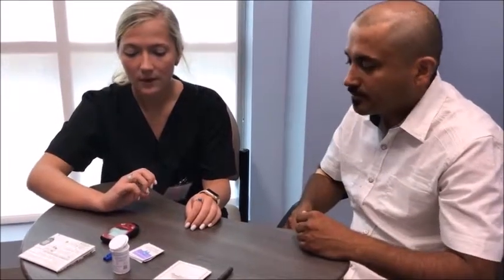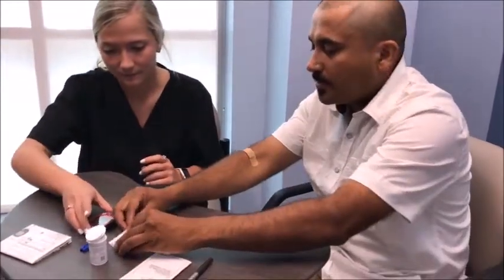I would also recommend, every time, getting alcohol pads and wiping that area before you stick it. Okay. So, all right, I think we're ready to go.